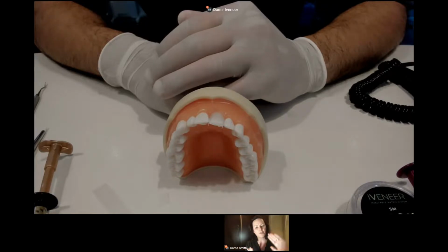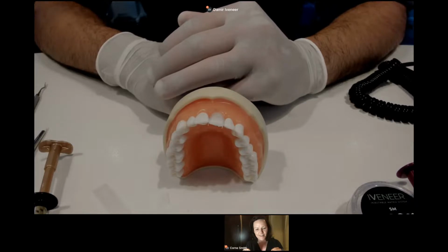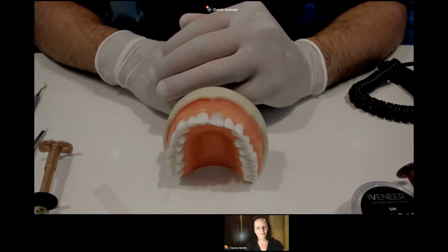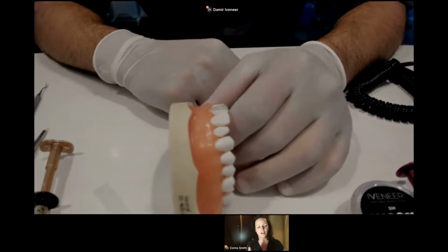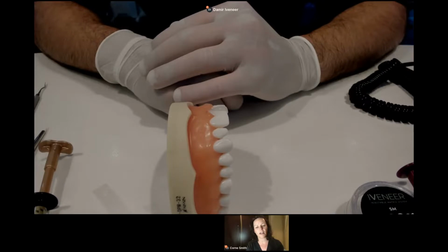Exactly. You just have to make sure that you close the palatal, you create your closed system, and you will build then a long tooth. And that's okay. And you can shorten it afterwards. If it's too short, you will want to. If it's too long, just cut it a little bit. That's all. So it's not always going to be the exact length that you need. You have to determine the length, and that's going to be up to you, not up to the matrix.